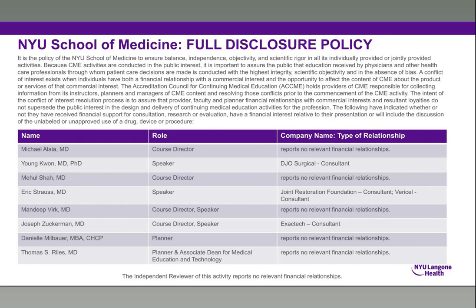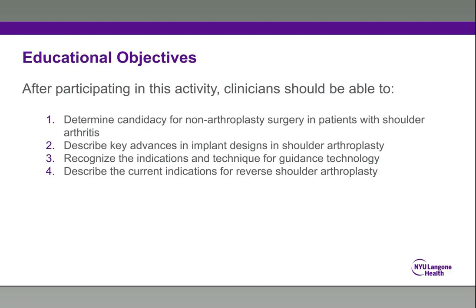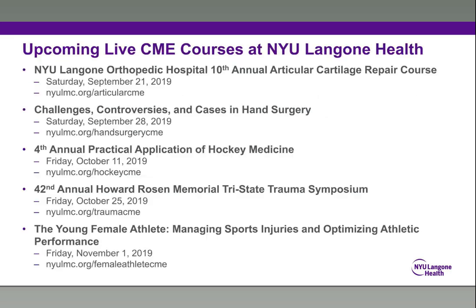So any contraindications in your practice for arthroscopic capsular release? Or would you offer it to any young patient? No, that's a good question. I also think it depends a little bit on the imaging that we're seeing. I'll be much more apt to discuss a capsular release for a patient that has arthritis but has some joint space present on their plain films. I'm hesitant to discuss it or indicate it for patients whose joint space is severely narrowed, where it's basically bone on bone.